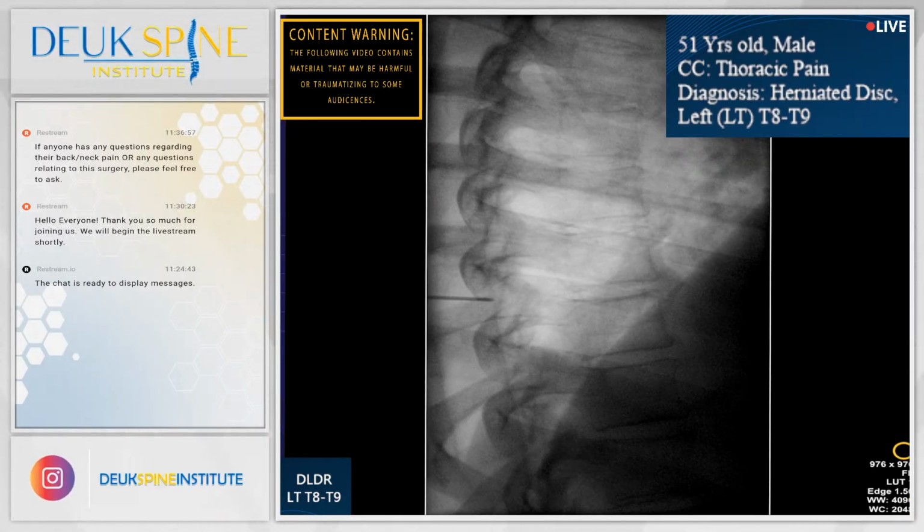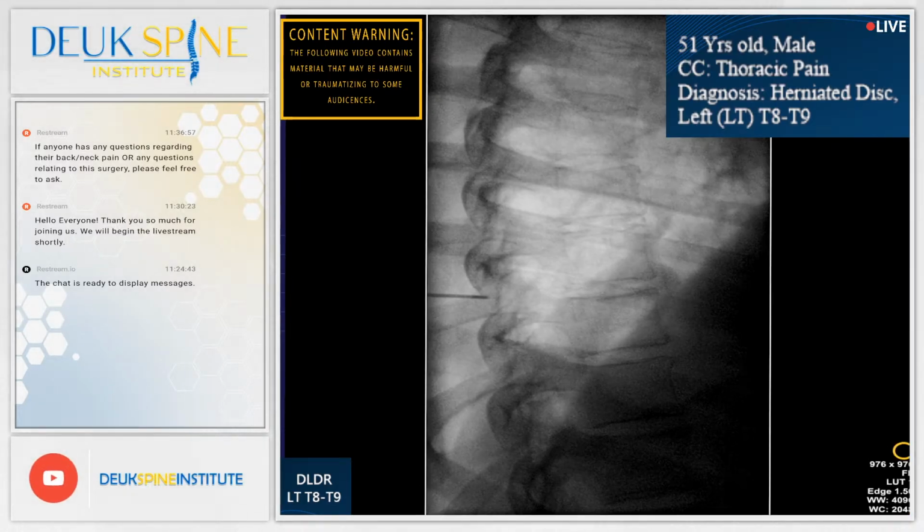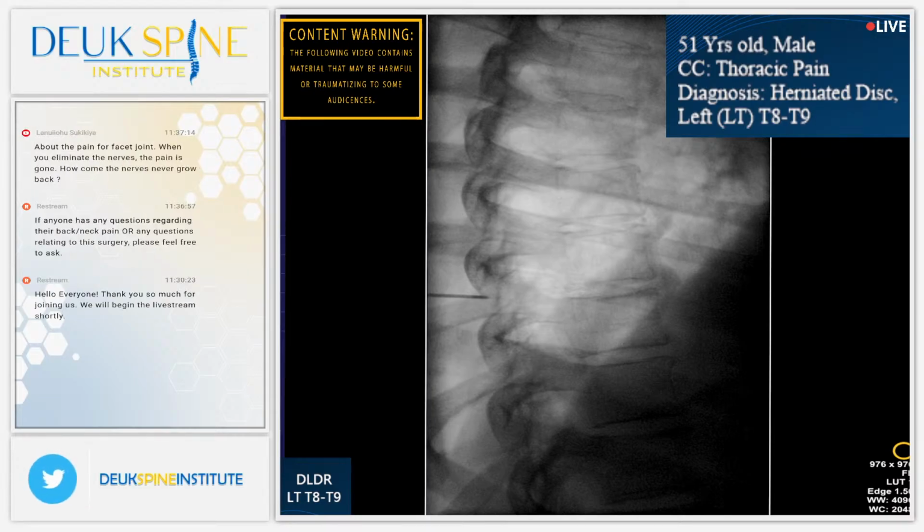All right, I think we went the wrong way, but let's do a little bit more that way, and just to verify. What do you think? Getting worse? Or did that get better? I think it got better too. So let's stay there. And I think the WAG is okay too at this point.